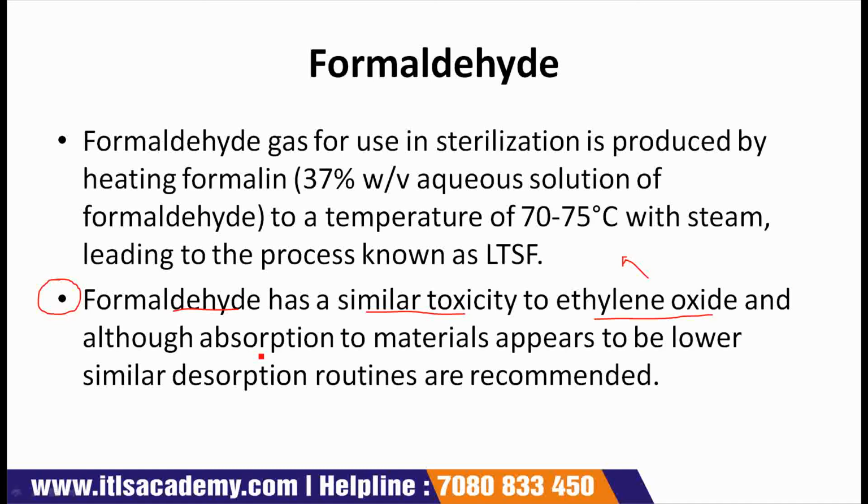And although absorption to materials appears to be lower, desorption routines are recommended. A major disadvantage of formaldehyde is low penetrating power, and this limits the packaging materials that can be employed to principally paper and cotton fabric.